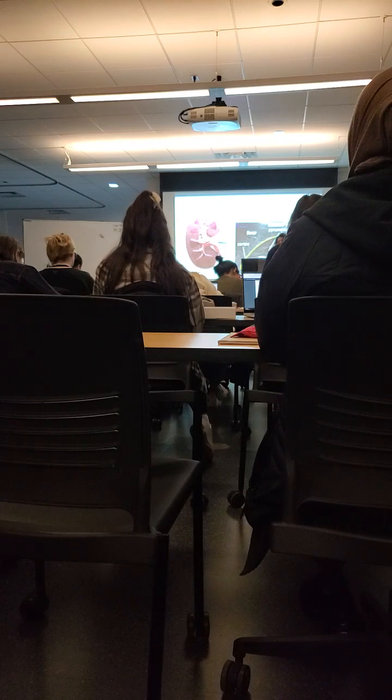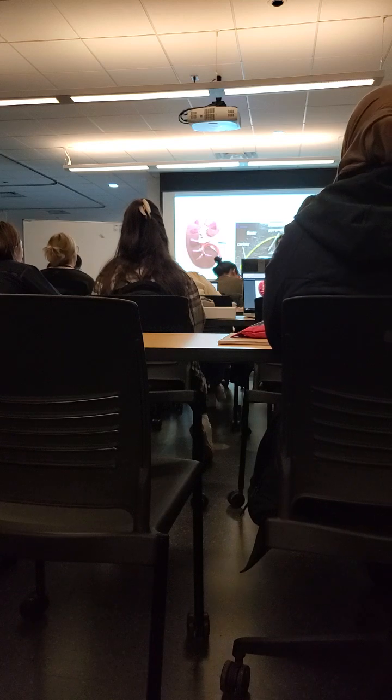So the echo texture is going to be different. This is your renal pelvis, right here. This is where, if there is a backup of fluid, we call it hydronephrosis. Did you guys cover that patho yet? Yeah. It's going to all build up in the calyces and the renal pelvis. That's where you're going to see it, okay? And that's why it's important to know the echo texture and what it should look like. Then we've got the medulla. The pyramids are anechoic for the most part. They're not cysts. That's why it's important that you guys know that they are anechoic.